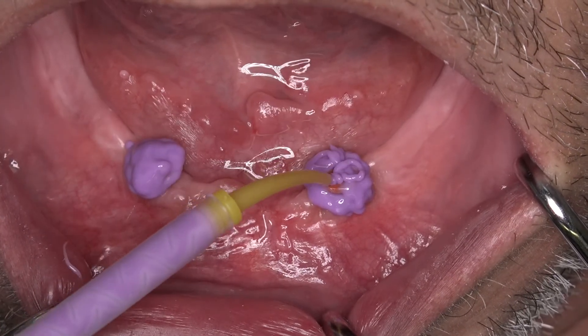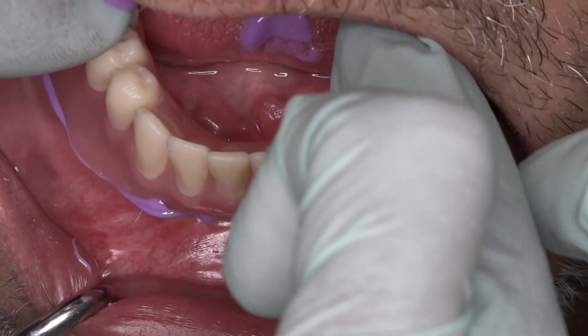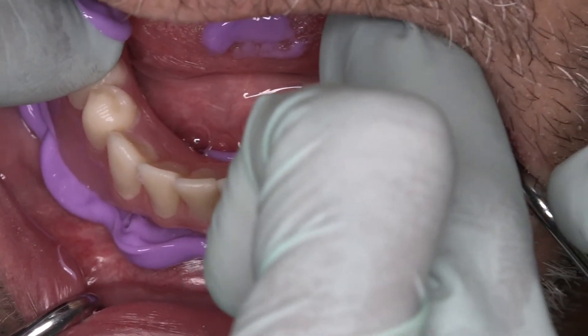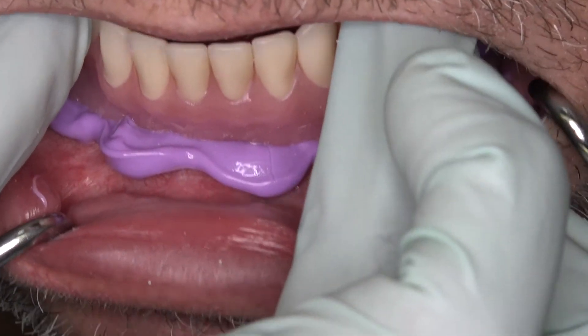If you want to take an impression, the particular component takes up less space, so it will be easier to pick that up within the denture base, rather than having to make significant changes to the denture to accommodate it, as was the case before.